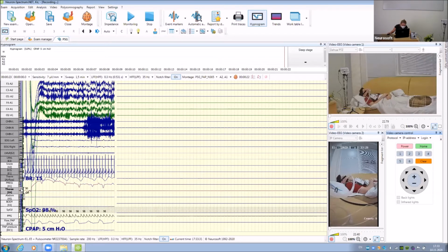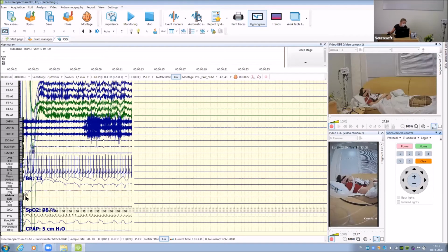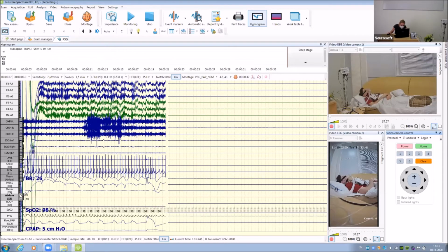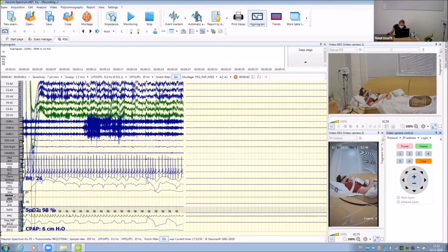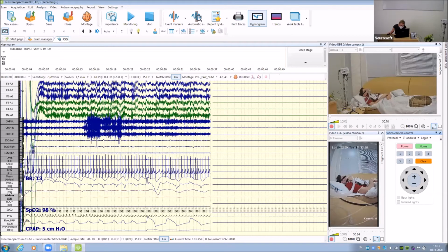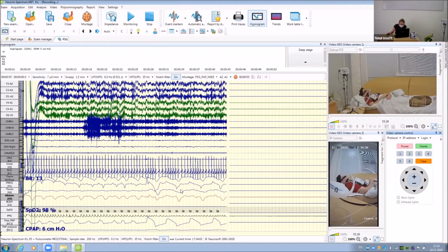And what's up with our breathing? It's not very good. Anton, please breathe deeply. So we should adjust the abdomen belt. Okay, here. So this is effort from the thorax and the abdominal belt.